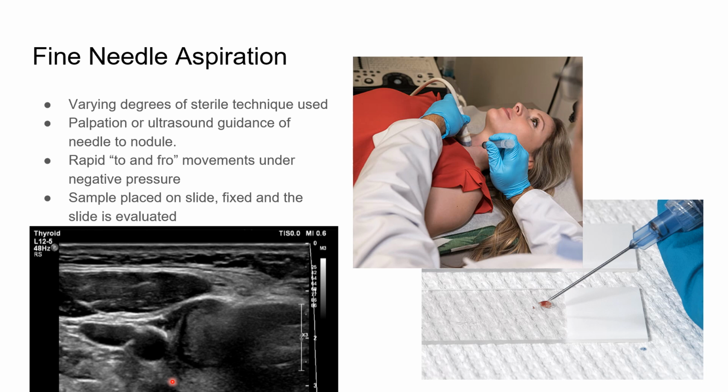Fine needle aspiration itself is shown here. There are varying degrees of sterile technique that I saw used. The radiologists that I saw almost went as far as the OR. I'm exaggerating a little bit there, but they were really keen on keeping everything really sterile. The cytopathologist I worked with kept everything as sterile as you would assume someone would when they gave an intramuscular injection. And that was kind of his reasoning for why he did what he did. And so there are different degrees to which that is used.